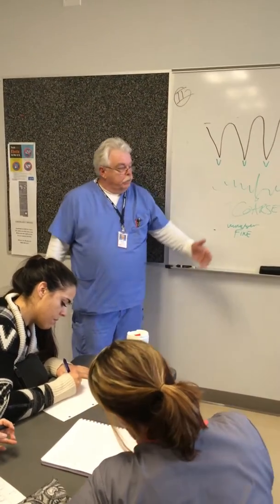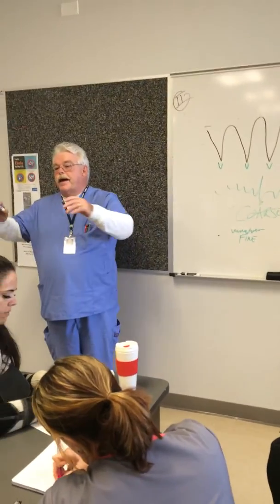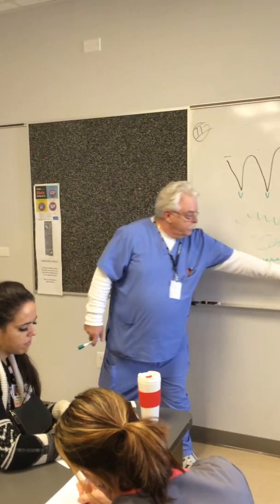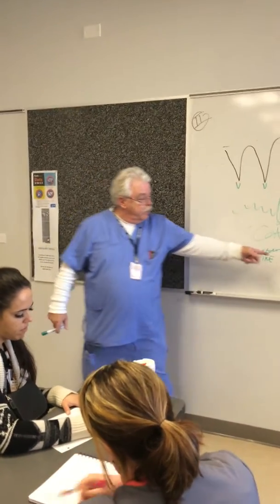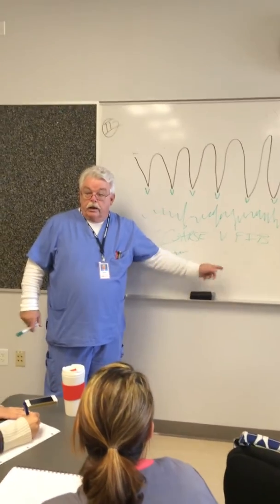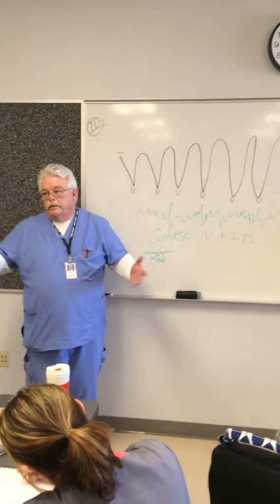The reason you shock somebody is to knock the heart off and say, let's start over. That's what a shock does. It's too late here, they're already dead. The only thing you can do here is CPR, compressions, and you give them epi. And that's it. That is not much.